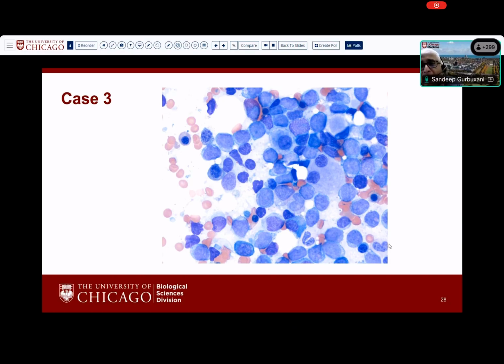And in the older classifications, this would be referred to as acute myeloid leukemia with myelodysplasia-related changes. We have started to move away a little bit from that classification because, again, most of the time, presence of these kind of dysplastic changes is associated with an aggressive disease and a bad outcome with therapy. But there are some cases where you can see these dysplastic changes, and there are certain mutations that pull them out of that poor prognosis group, particularly mutations in transcription factors like CEBPA, and sometimes you can see megakaryocytic dysplasia in NPM1 mutated leukemias as well.